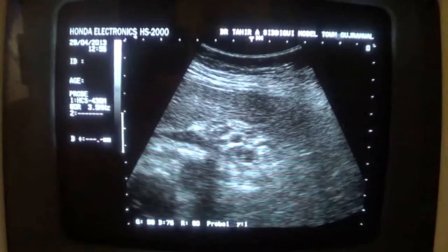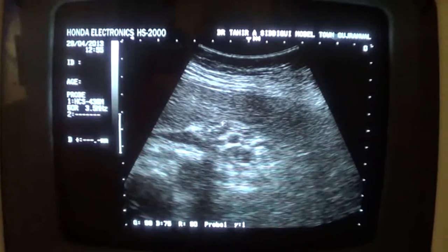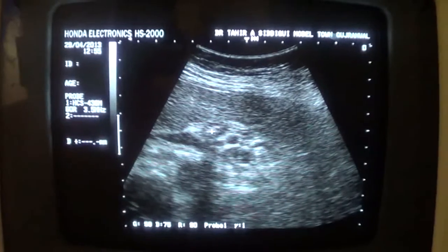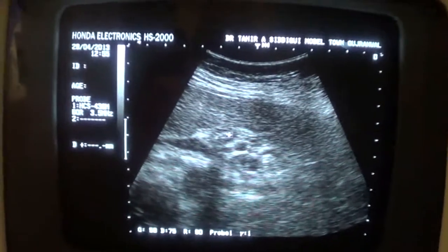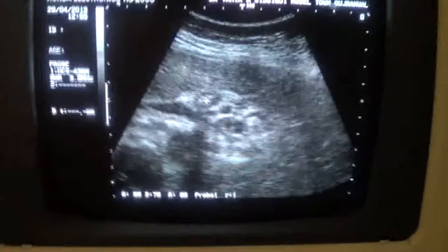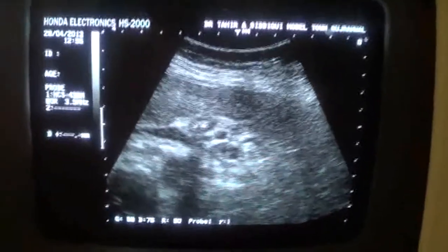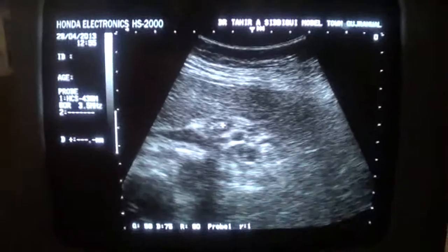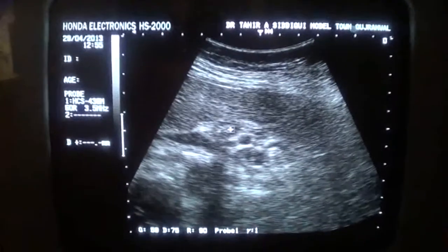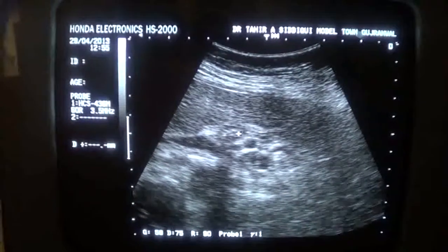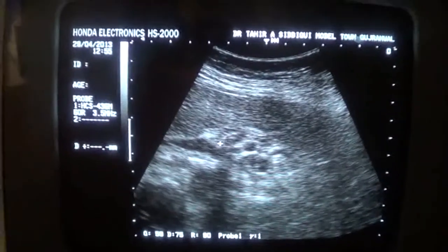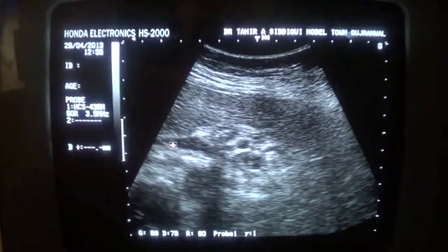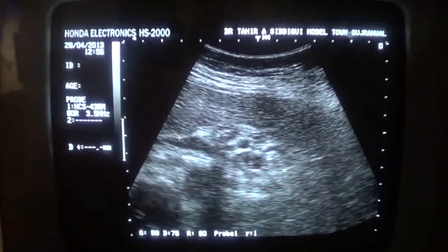This is the gallbladder in transverse section, and these tiny echogenic areas within it are the calculi. Now you can see.